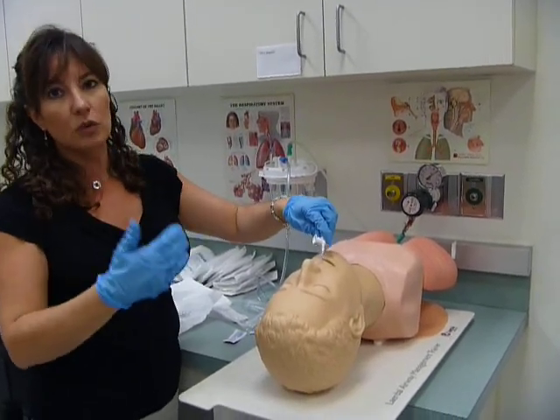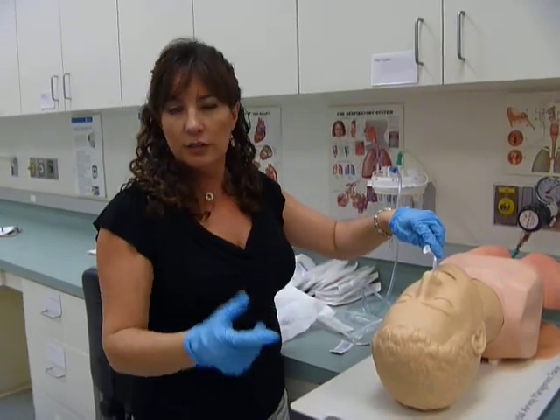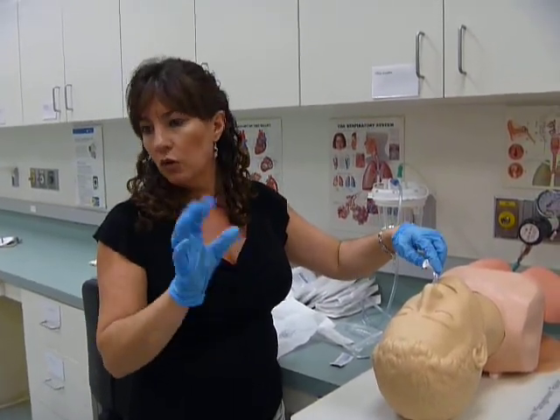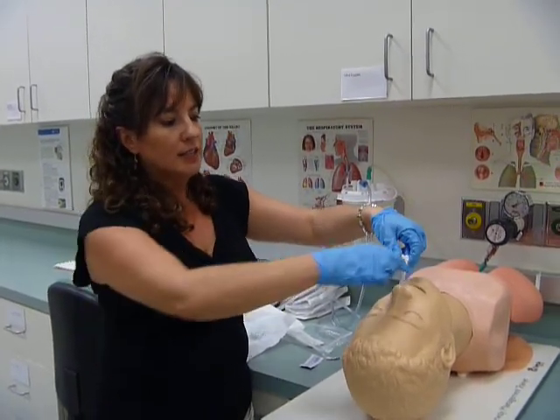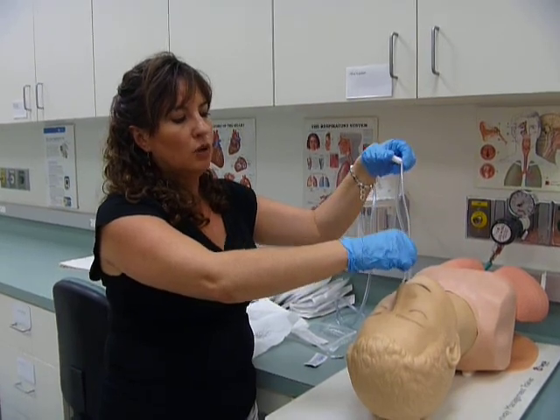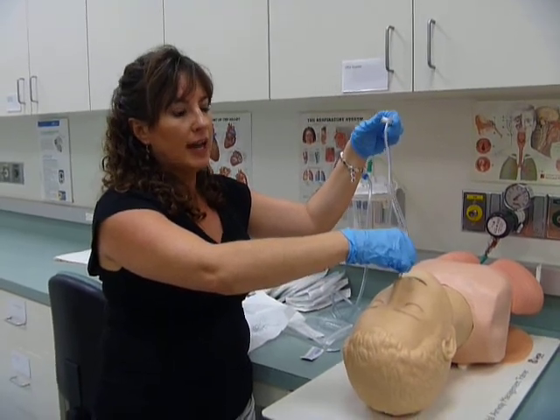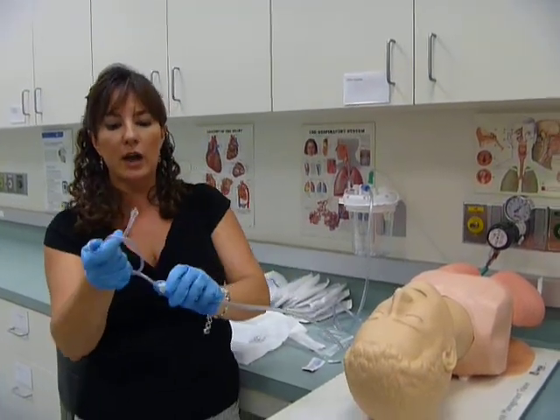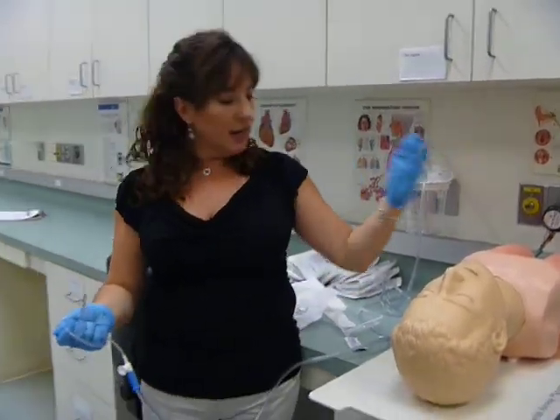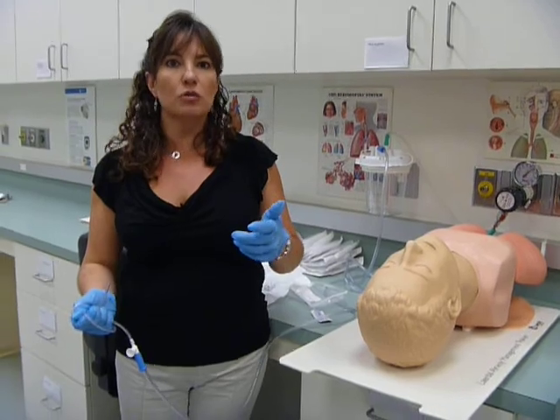So if I feel resistance or a cough reflex, what have I hit? Carina. So if I see a cough reflex, good. If I don't and I feel resistance, I can't go anymore, or if I can't go anymore because I've advanced it all the way down, now I apply suction and I pull it out. And again, I keep advancing my hand down the catheter because I don't want to pull it out and have it flip someplace and touch something and now it's no longer sterile. Now I wrap this up and I let him take a few breaths and I assess, do I need to suction again? If I got a lot of secretions, I'm going to suction again.